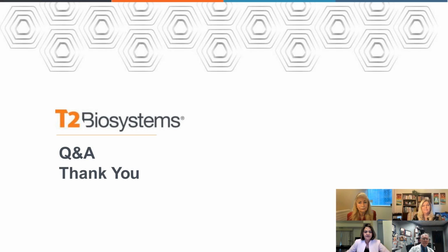Thank you so much. And Dr. Uettwiller-Geiger, I've got a question for you as well. Our next question, why did you focus on collecting data from the ED? Well, we found that the emergency room was our #1 orderer of blood cultures and thought that having rapid, accurate diagnosis of sepsis for the emergency room would be most important. 80% of our admissions occur from the emergency room, and we thought that was a good start point in our specific patient population.